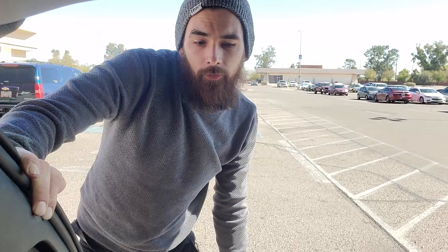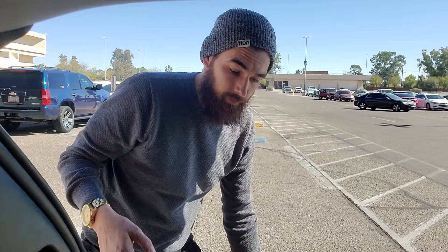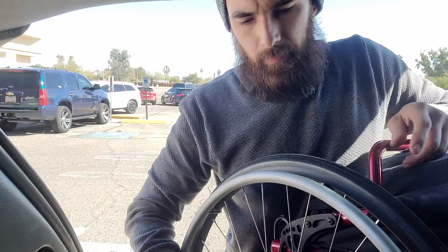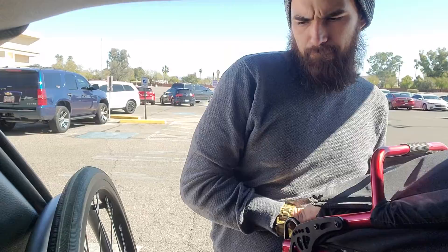Hey everyone, this is how I load my wheelchair in the back of my Jeep. I should build a smaller speaker box so it'll be easier to put it in. What I typically do is pick it up into the car, then remove my left side tire, and then reach over.